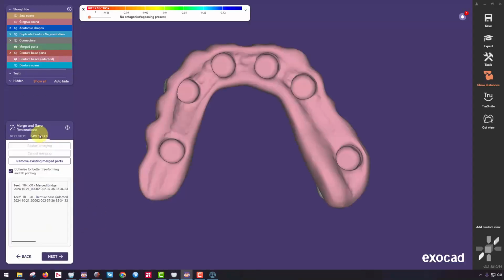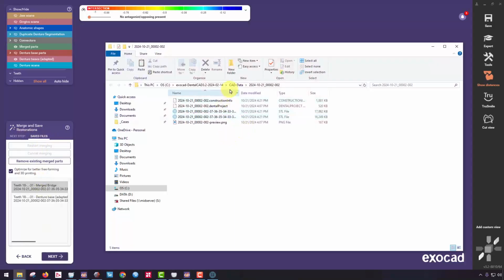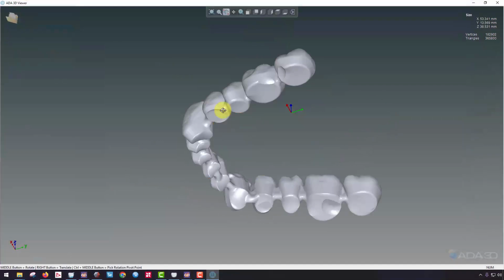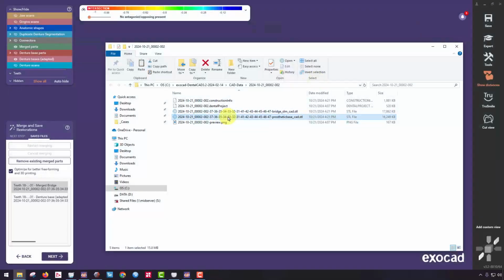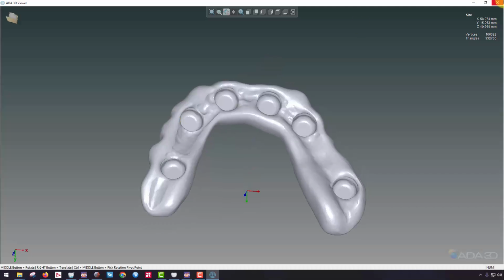And if I click on the Saved Files button right here under the wizard, double click this, I'll go ahead and see here I've got my 2 STL files. Here is my bridge. And then here's my denture base.